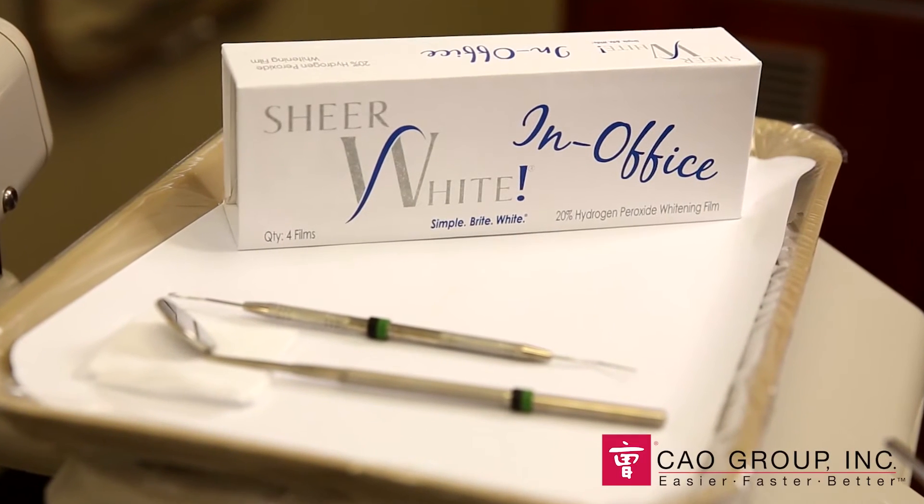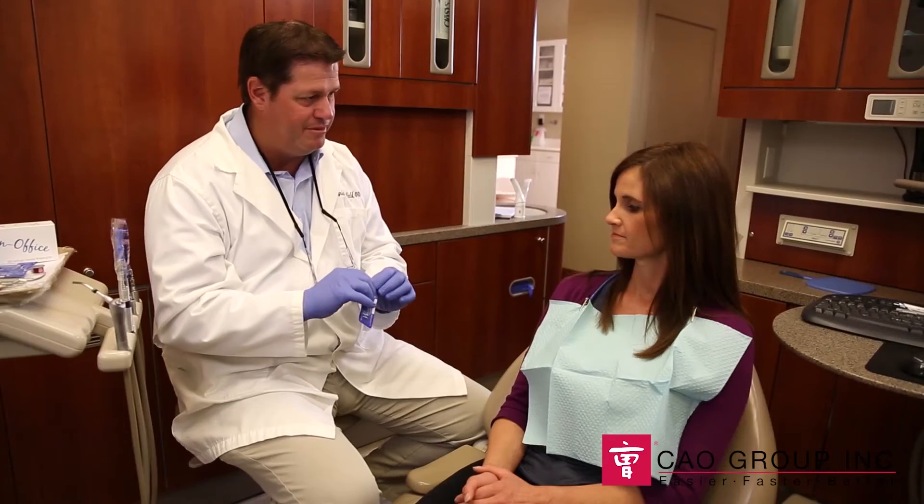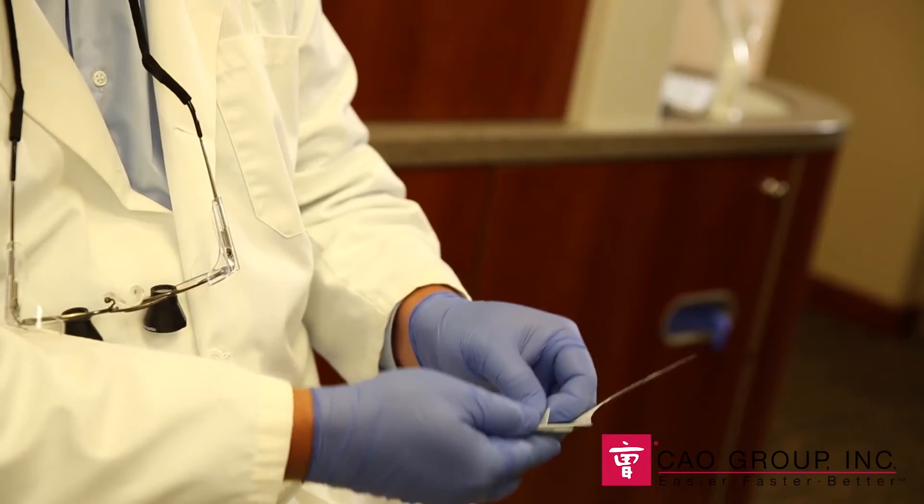Well, I'm here to talk to you about that. Let's go take a look. The new Shear White In-Office Whitening Strips deliver the professional results you expect from an in-office whitening product, but takes less than a minute to apply in the chair and you can send the patient on their way to comfortably complete the 30 minute whitening process.